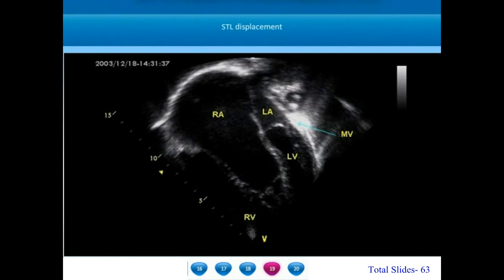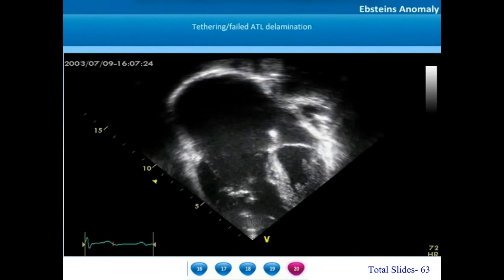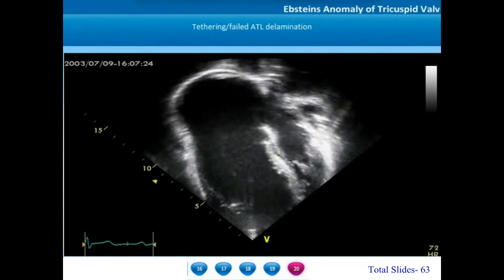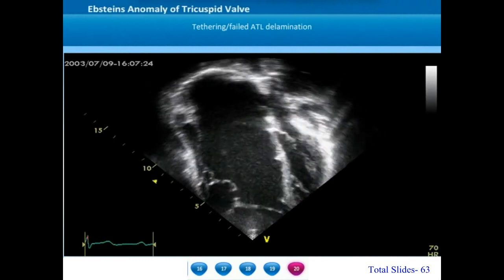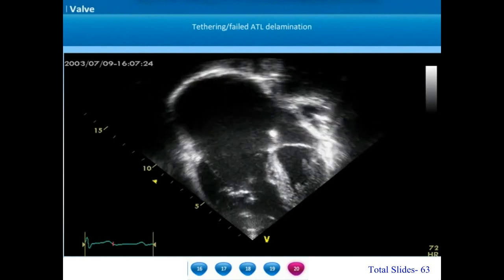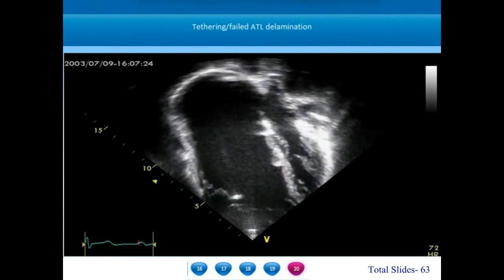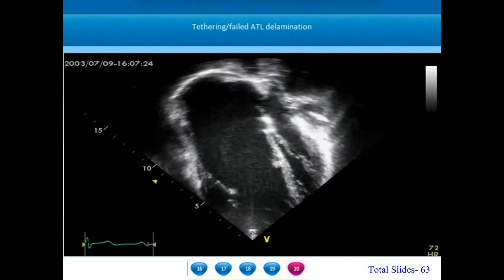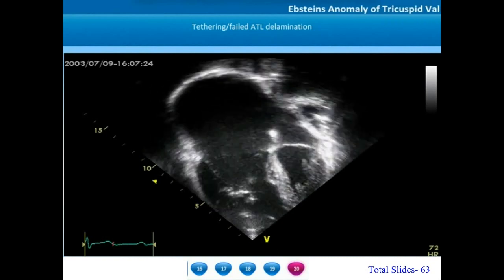This reduction in LV preload will have an impact on low cardiac output. In this apical view, we can appreciate the dilatation of the right atrioventricular valve annulus, a marked tethering of the septal tricuspid leaflet, and significant tethering and failed delamination of the anterior tricuspid leaflet. This results in absolutely no coaptation between the ATL and STL, leaving behind a huge regurgitant orifice.